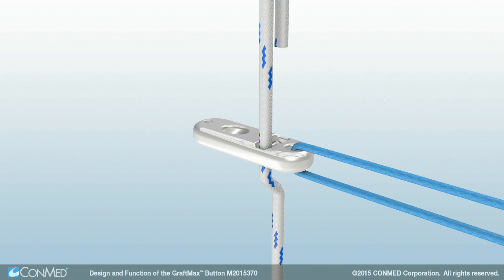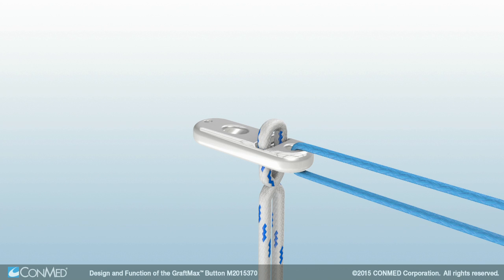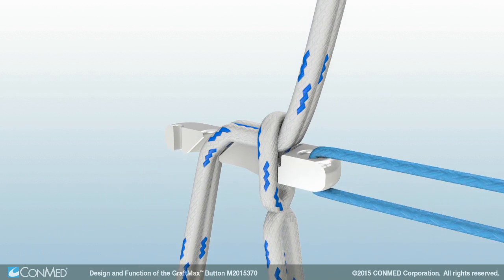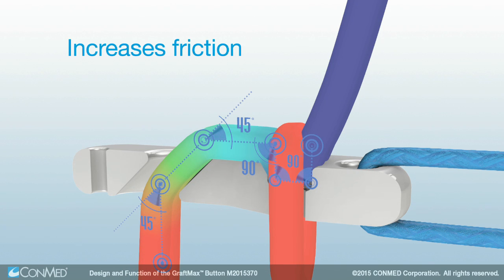This ultra-high molecular weight polyethylene suture is assembled featuring a locking loop which sits above the locking pocket on the top of the button. The adjustable loop is then created by passing the suture tails through the button's tortuous path and under the locking loop. The tortuous path of the suture through the button increases friction and reduces force with each turn to just a fraction of the original at the point of locking loop contact.